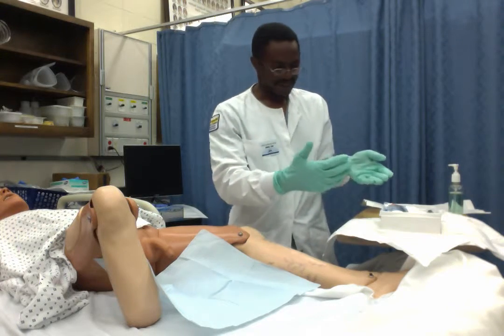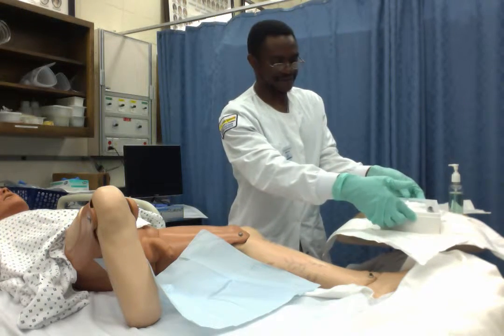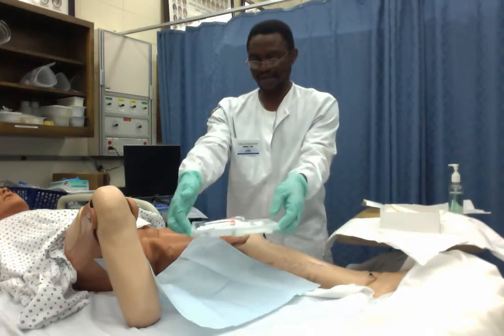At this moment, I will want to extend my sterile field down to the bed.